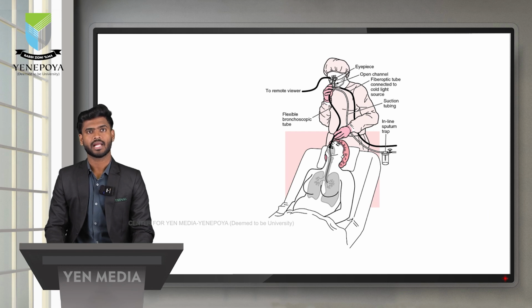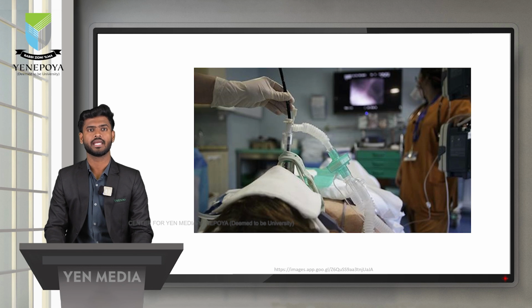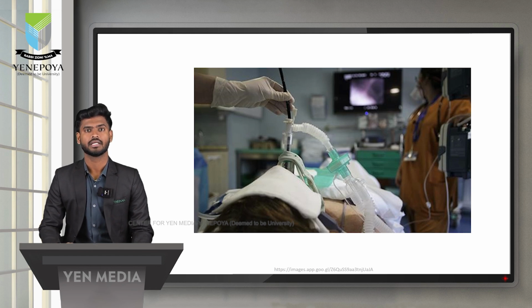This image shows the practitioner using a flexible fiber optic bronchoscope, and it further moves into the left main bronchus. So only the practitioner can see where the bronchoscope tube is inserted and placed. In this image, you can see the practitioner inserting a bronchoscope into the patient's airway. Not only the practitioner can see the lung parenchyma, but the nurses, respiratory therapists, everyone can see the lung parenchyma. Whether the tube is inserted in the left main bronchus or right main bronchus, or further divided into the bronchi, everything will be seen in the display.